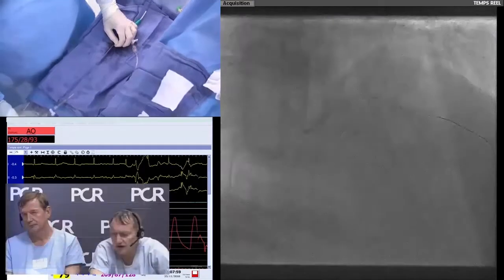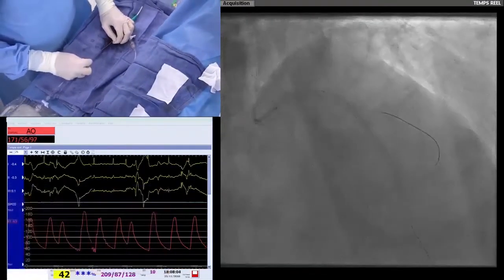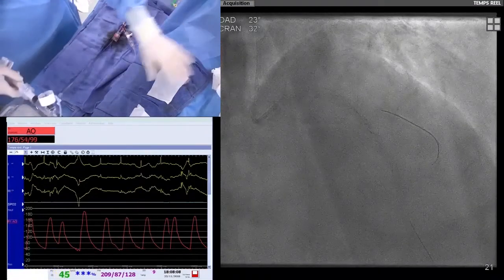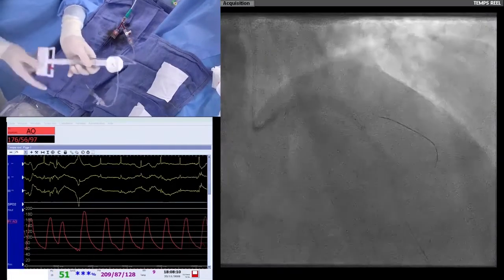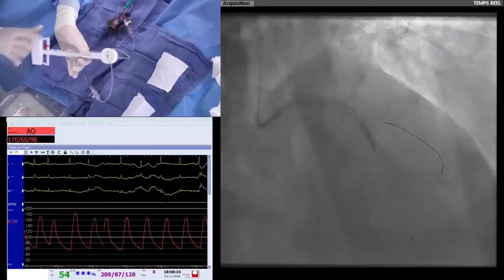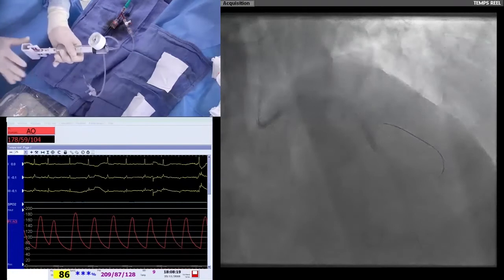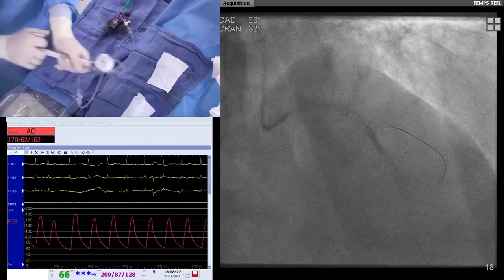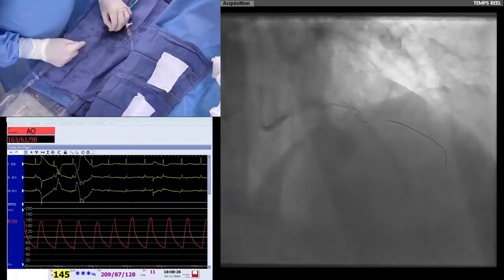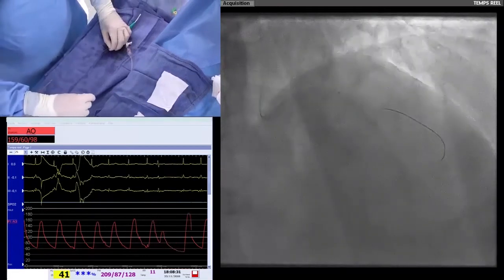I have 3.5, okay. Yes, I forgot because we are discussing, and I have to perform a post dilatation also of the left main in the overlap between the two stents. So first, I perform an inflation using a 3.5 balloon at low pressure. This is 6 atmospheres. I think it's okay. Just in the overlap part, and then I will perform a POT more proximal. Okay.